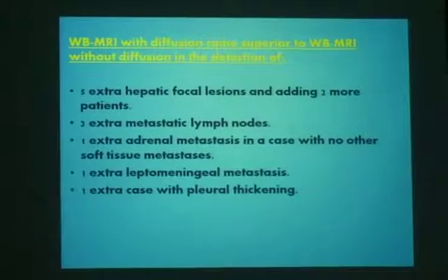Then there is the detection of soft tissue lesions. Again, diffusion came out superior; the addition of diffusion to the whole body imaging rendered it more superior in the detection of some of the soft tissue lesions. These are examples of some of the cases.